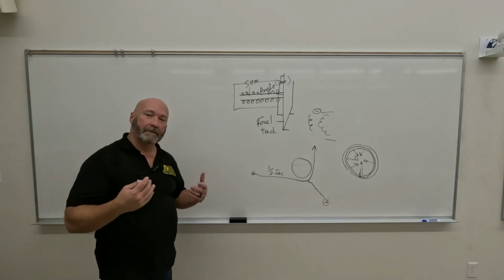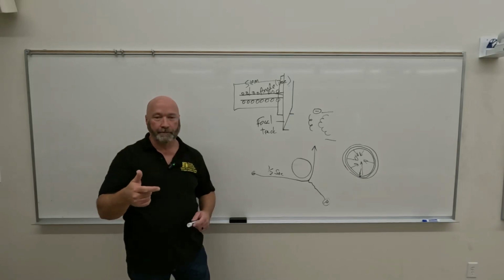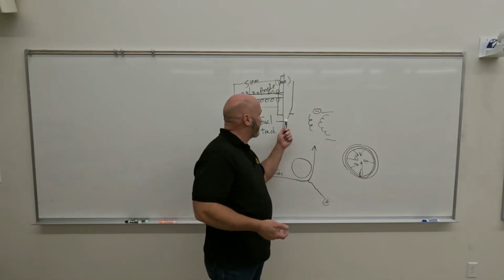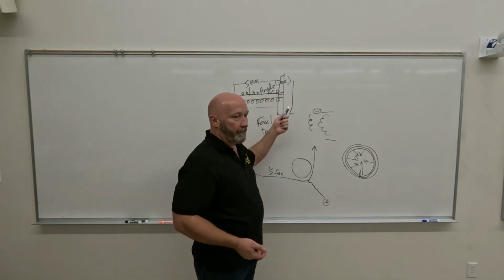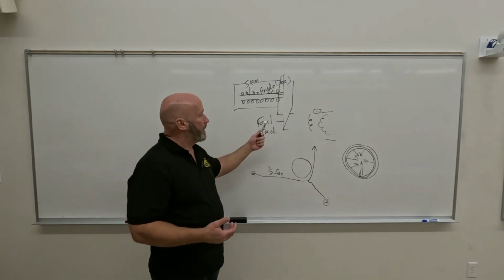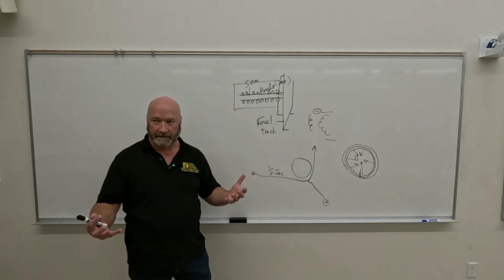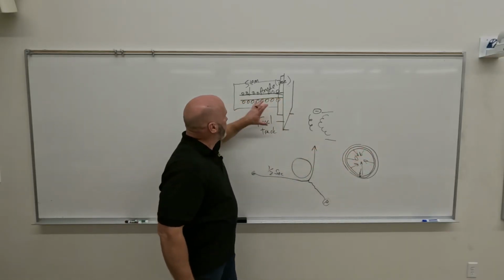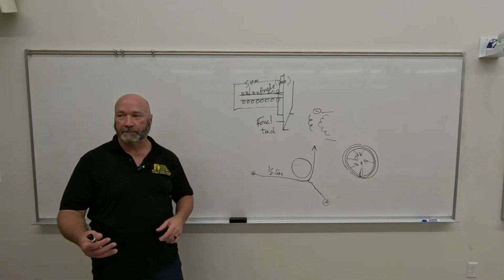So we just kind of slammed on the brakes. What are the ways that we reduce heat in the X-ray tube? Conduction, convection, thermal radiation, right? So thermal radiation from here down to the glass, conduction into the oil, but also conduction all the way around this. For right now, convection just doesn't play a part. But here's the thing: we want to conduct the heat as much as we can around the face of the anode, but we don't want to put it right here. We don't want it going down the stem as much as we can stop it.